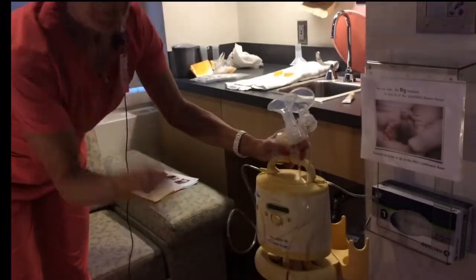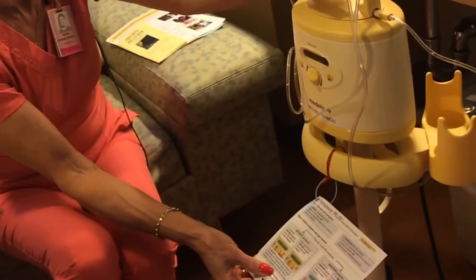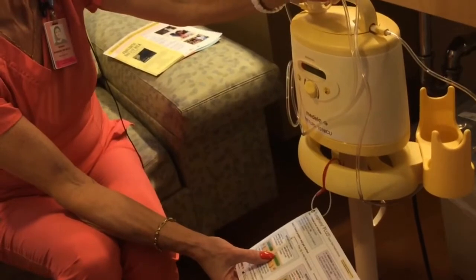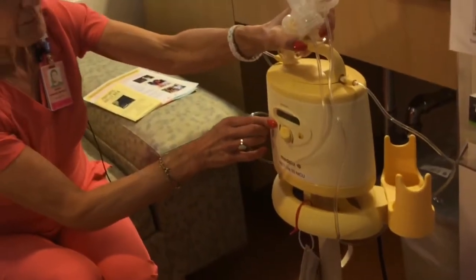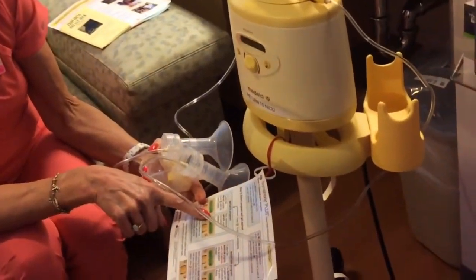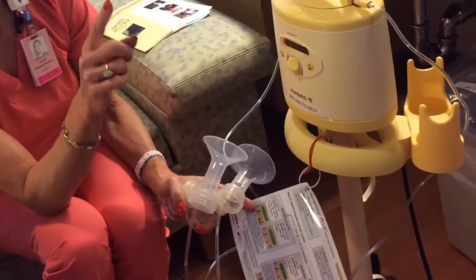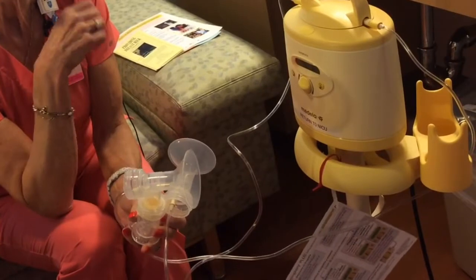Then mom turns the pump on. There are two programs on this pump. The first is the initiate program — that is the program that all moms should use in the first three to five days. The mom hits that button and then that button to go into the initiate program. This program lasts fifteen minutes, beeps, and shuts off. Moms should use this initiate program until they produce twenty mLs combined from both bottles, twenty mLs times three, or by day five.